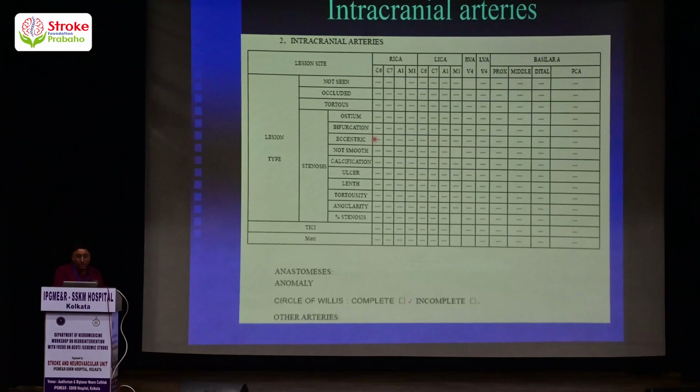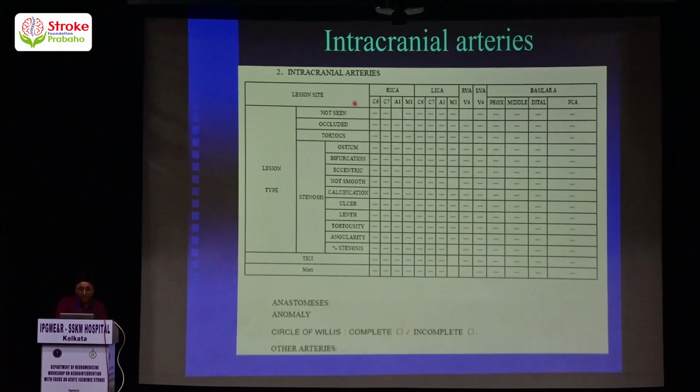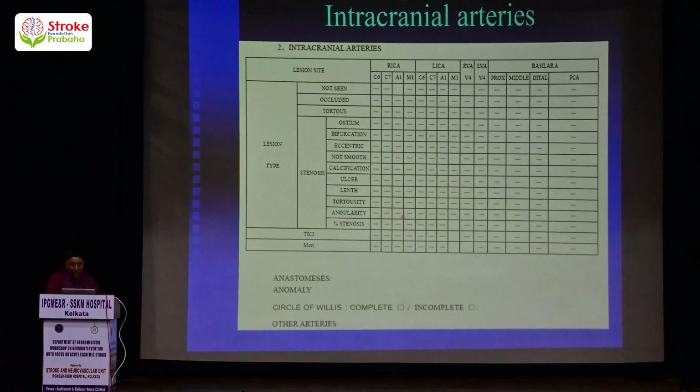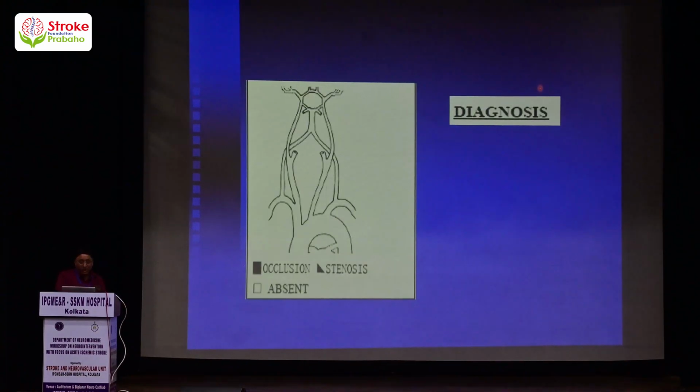And for the intracranial circulation, again we see the intracranial carotid system, the intracranial segment of the vertebral artery, basilar artery, all segments, proximal, middle, and distal. How the PCA is looking. If there is any stenosis seen in this artery or not, occluded, or vessels in proximal. So we have a very extensive table-based description of the DSA, and then we mark where the stenosis or aneurysm is on this diagram, as the coronary people do very often.